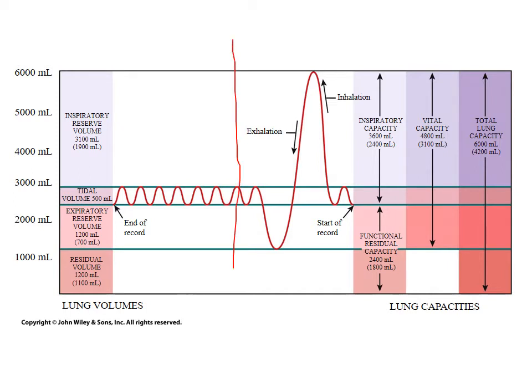And there's a dividing line. This side is going to be what are called lung volumes, and there are 4 lung volumes. All right. And then this side are called capacities. And this is where I take the volumes and combine them to get a better understanding of what's going on. And again, there's going to be 4 of these.